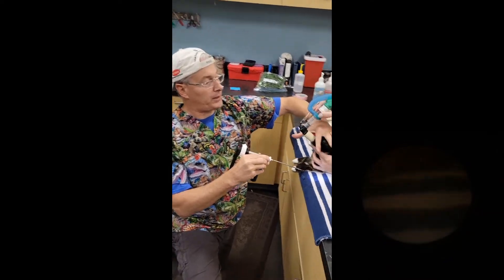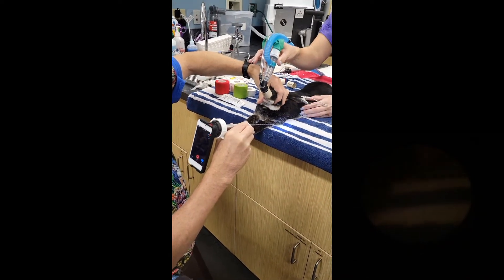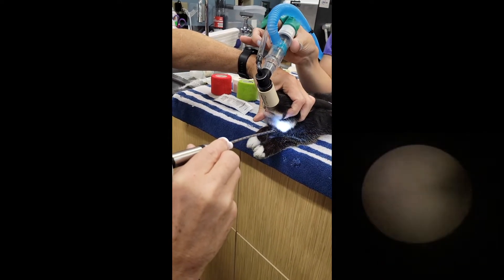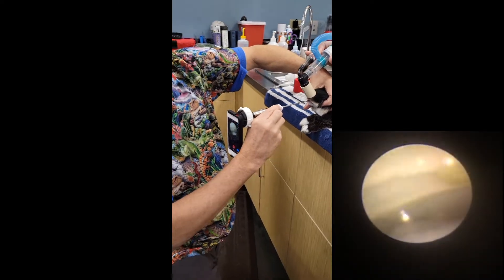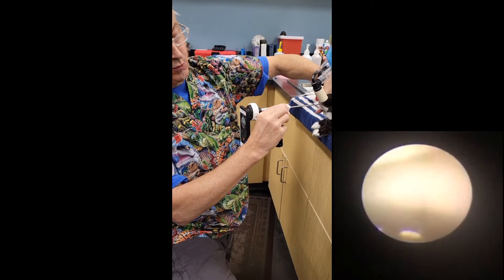I'm going to put the bunny's forehead in the palm of my hand, and with my thumb and index finger make him smile a little bit — grinning. Then I'm going to put his head low and pull him towards me like he's a snake a little bit. I'm going to go into one side of his incisors, and now I'm going to start watching my screen looking for the seam in the roof of the mouth.